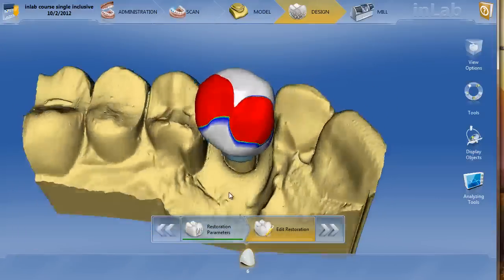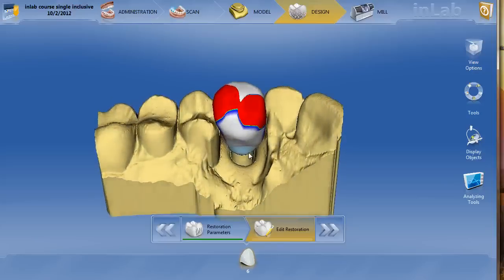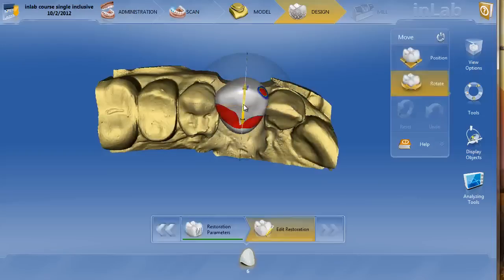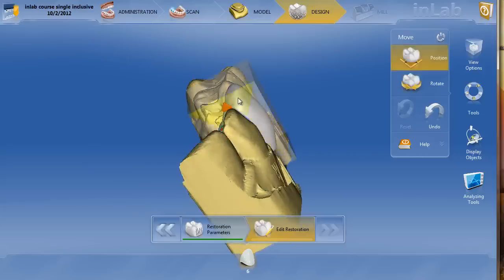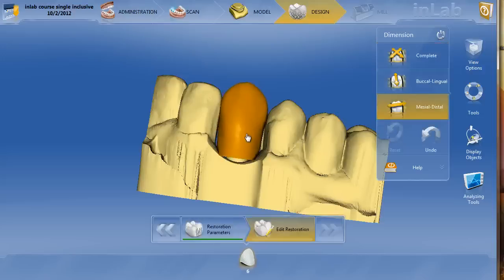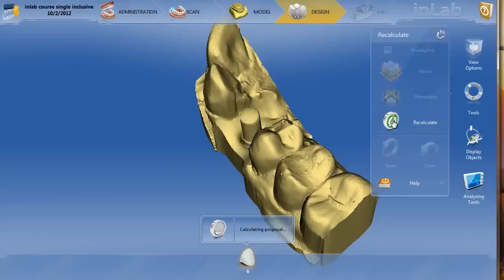My initial proposal is very poor — I remember this vividly. Whenever I get a proposal that's this far off, I'm not going to mess around with it much in the software. I'll go ahead and use recalculate unadapted, then use the move tool to manipulate this crown into the correct position. You can use the space bar to toggle between the position and rotate tool to get it in the ballpark. I can see the contacts are too wide mesial-distally, so we'll close out of that, go to the dimension tool, dimension mesial-distally, and narrow that up just a little bit. Once you've got it close, we'll recalculate the proposal and get our new proposal.